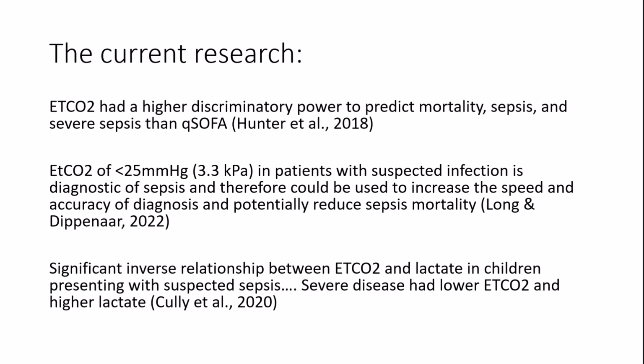And the third one is a significant inverse relationship between end-tidal CO2 and lactate in children presenting with sepsis. Children in particular are a very important demographic when it comes to sepsis. There's an increased risk of them deteriorating quite quickly, and things like a respiratory infection can quickly lead to sepsis if not identified early. So if you have a child presenting with infection, I'd always recommend, if they can tolerate it, to put some end-tidal on them and to observe what the readings are saying.